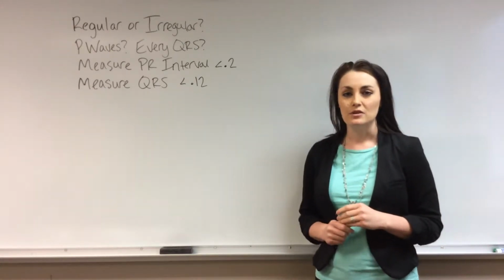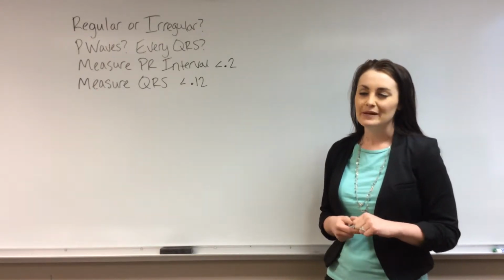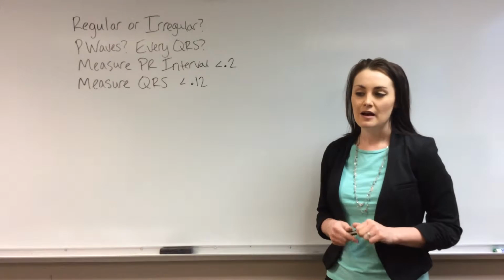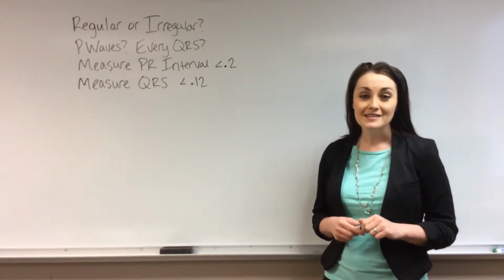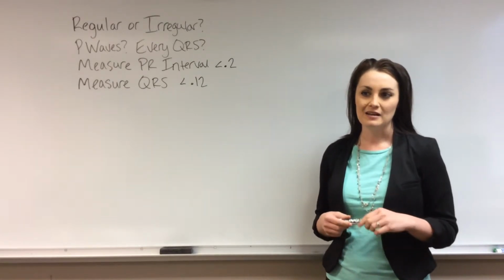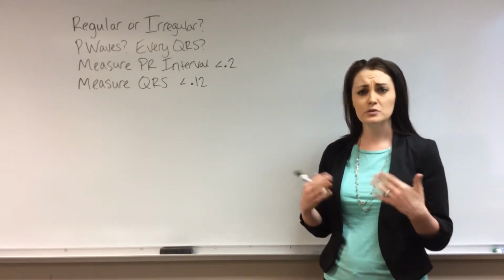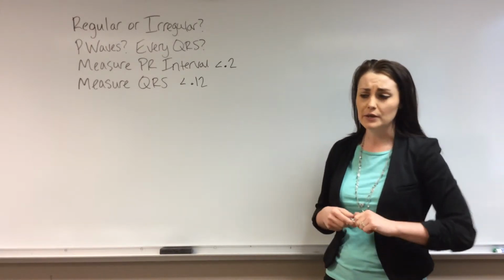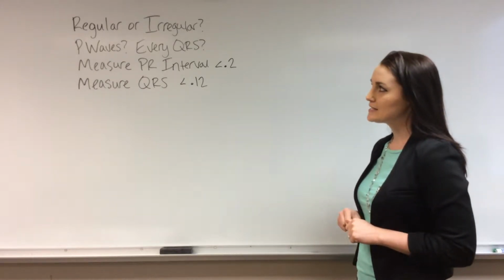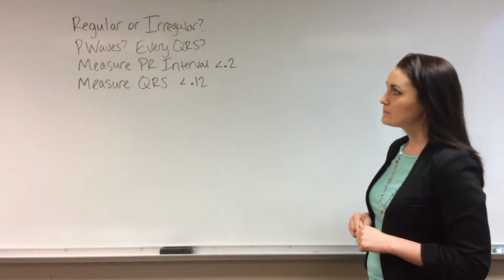And so this isn't meant to be 100% comprehensive on every rhythm that you'll encounter, but it is a good way to start thinking about a method to analyze the rhythms. The goal is for you to have a process in place. Instead of depending on just pure recognition of the rhythms, having a method and steps that you can follow so that you can have the tools in place so that you can analyze any rhythm that's put in front of you. So I listed a couple of the steps up here, and these are the ones that I'm going to be referring back to as we're going through the different rhythms. And so I'm going to leave those up.